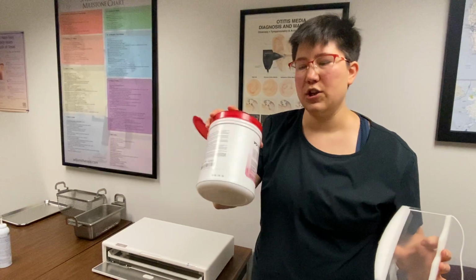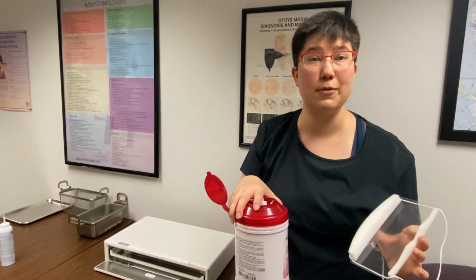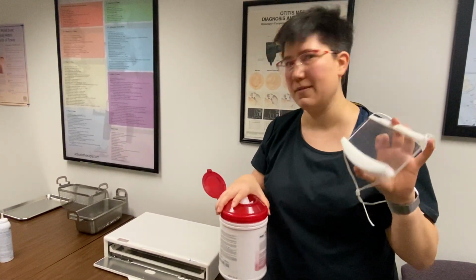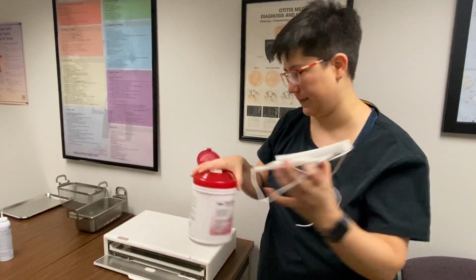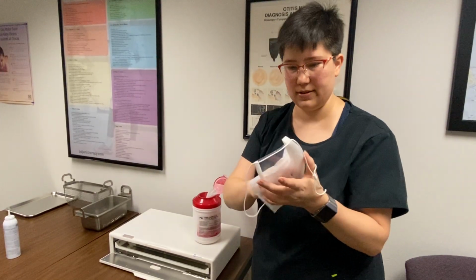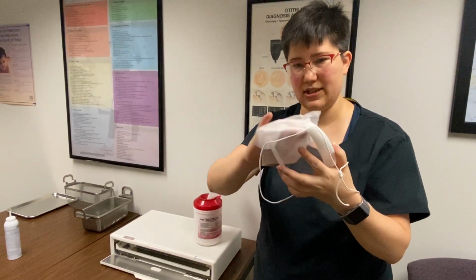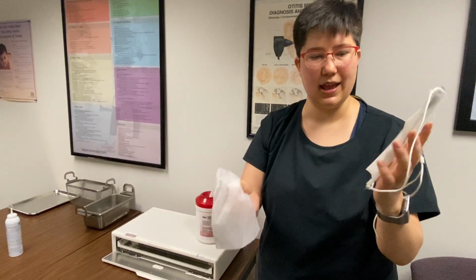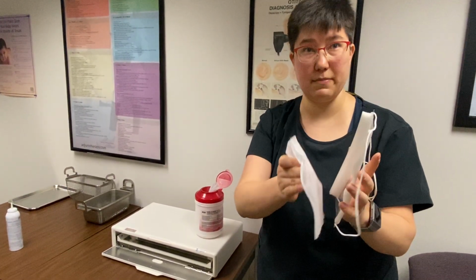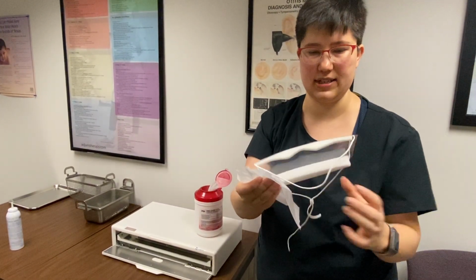For these, you're going to use the red canister wipes. These do not kill COVID, but they kill most everything else, and they're gonna get the spit off. Don't use the purple jars for this because we have a second step of cleaning these. So, you pull the wipe out and you wipe it in a parallel motion, because if you do a swirly motion, A, you're gonna miss things, and B, you create swirl patterns that are harder to see.